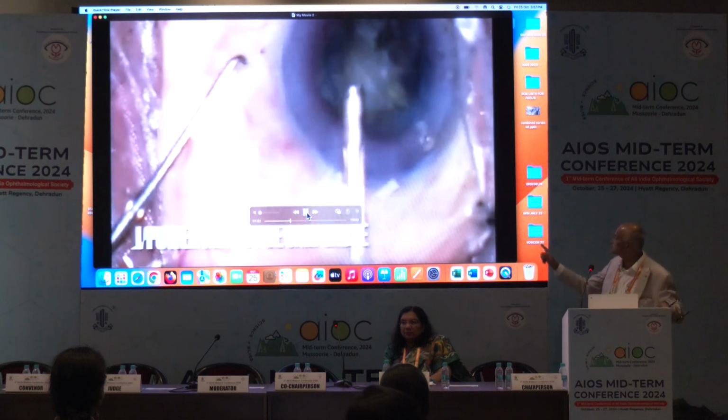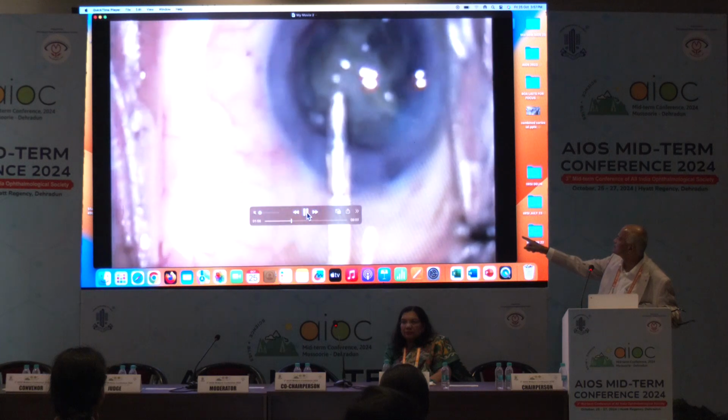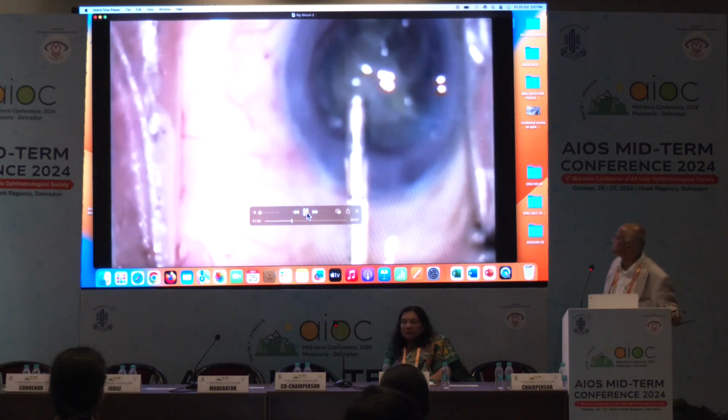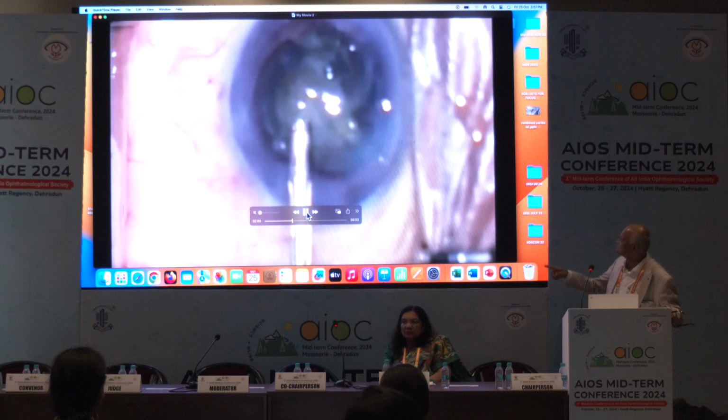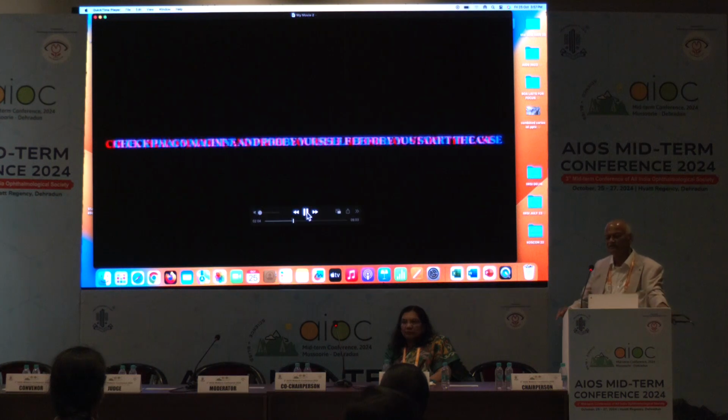Now see, the phaco tip is moving. I am operating, but my phaco tip is moving, and I am just trying to put the phaco tip inside, and you can see it is a broken tip.